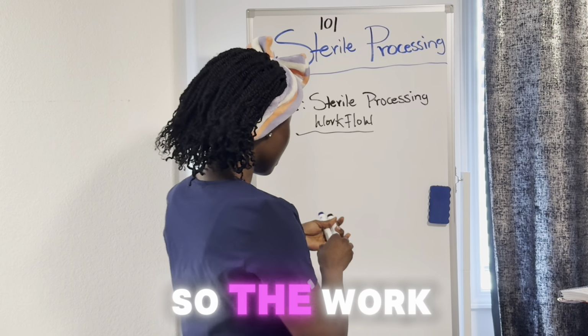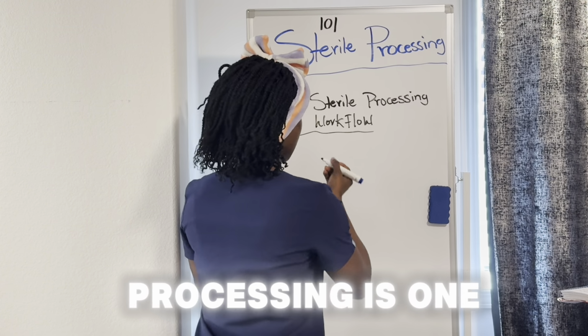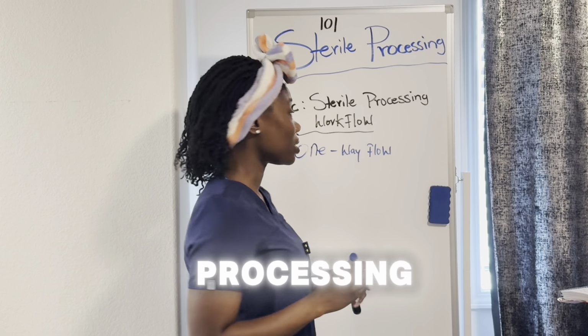So the workflow for sterile processing is a one-way workflow. It's a one-way flow. So what are the steps of the one-way flow for sterile processing?